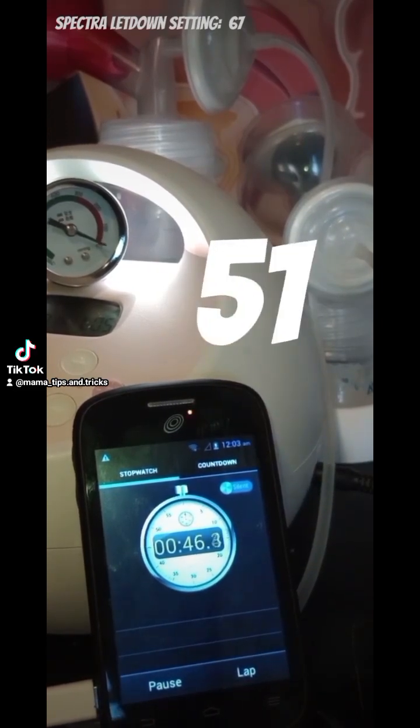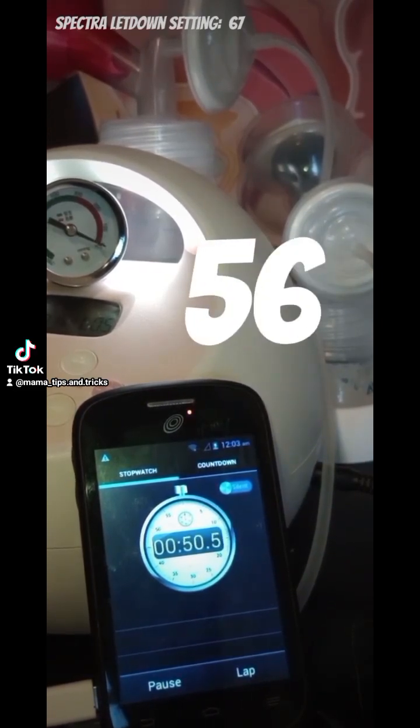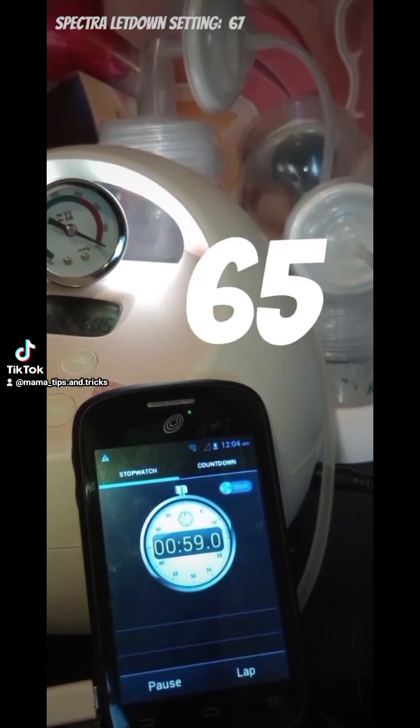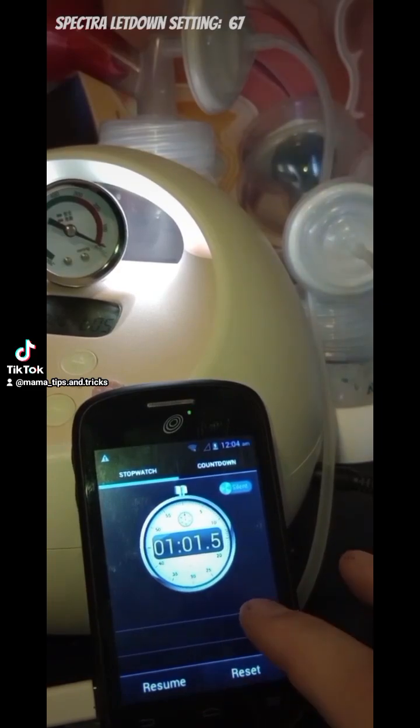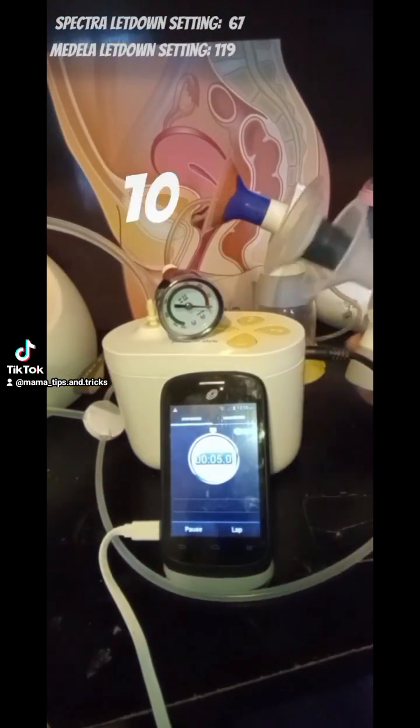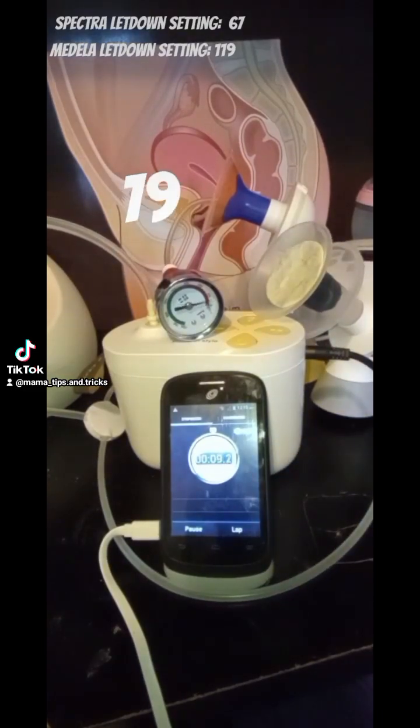On the Spectra, it says 70 for the cycles on letdown setting, which means that's supposed to be 70 pumps per minute, but I only got 67 when we counted it out for some reason. So I take the same setup and I go over to the Maxflow and I put the vacuum meter on it just to count out how many pumps per minute is on letdown setting.